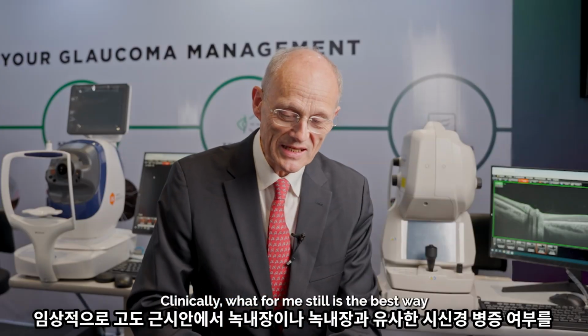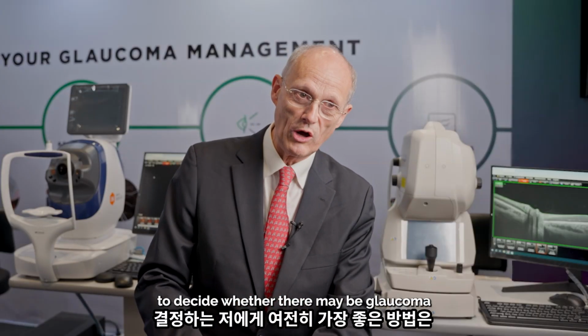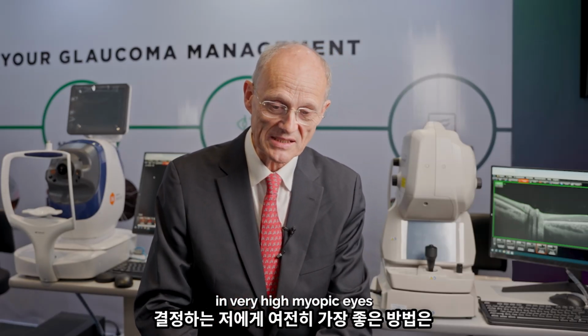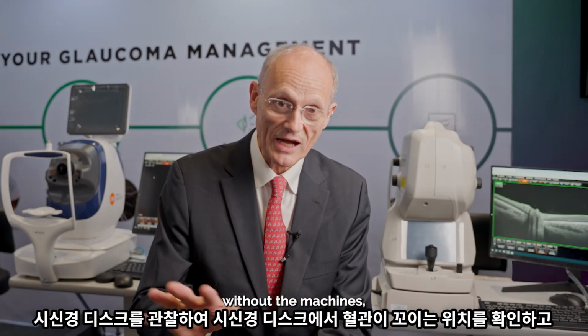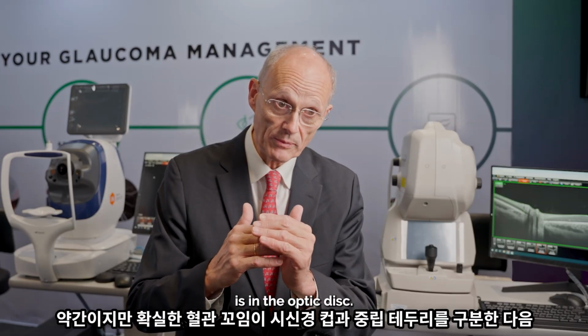Clinically, what for me still is the best way to decide whether there may be glaucoma or glaucoma-like optic neuropathy or not in very highly myopic eyes is still the ophthalmoscopic look onto the optic disc without the machines, to see where the vessel kinking is in the optic disc.